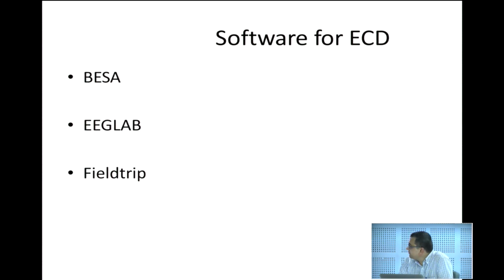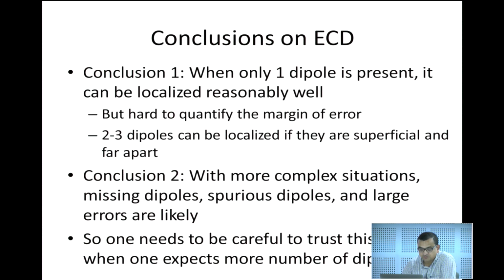As I mentioned, BESA is the first, that's where the company is formed. Then I talked about EEGLAB. EEGLAB also provides the ECD approach, and another dominant toolbox, FieldTrip, which is MATLAB based, also allows you to do equivalent current dipole.